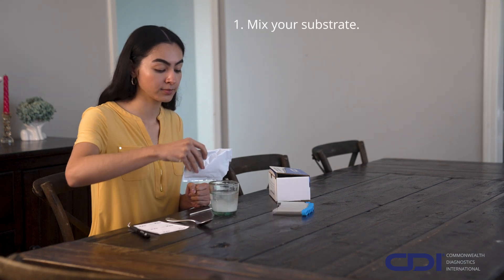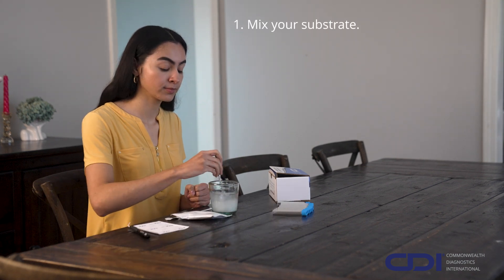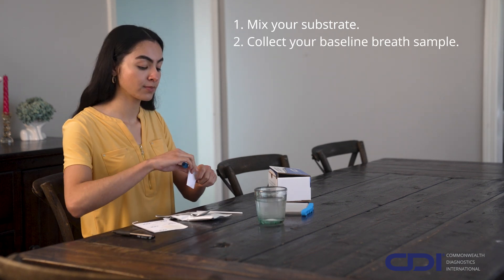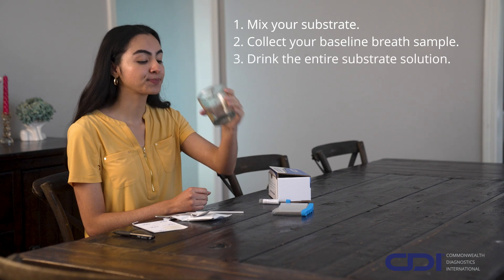On test day, after fasting, mix the substrate with water, but don't drink it yet. Collect your first breath sample to establish a baseline, label your sample, and then drink the entire substrate mixture.